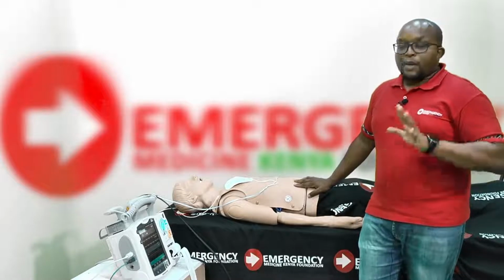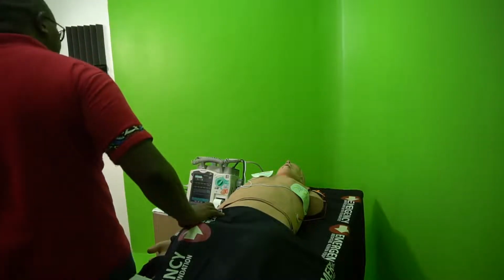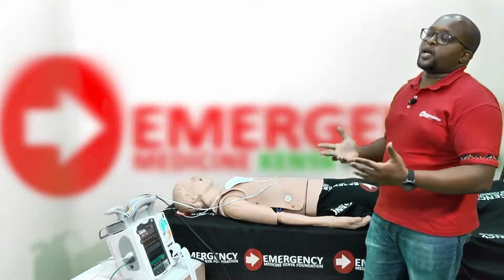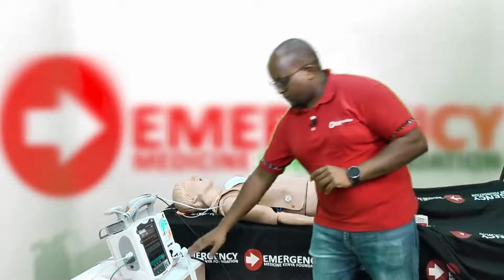Now, my patient is being paced. I have confirmed I have electrical capture, I have mechanical capture, and the patient is now feeling a bit better. The blood pressure is coming up. He's well perfused, he's stable. All right, so I have physiological capture, and then I put a safety margin.